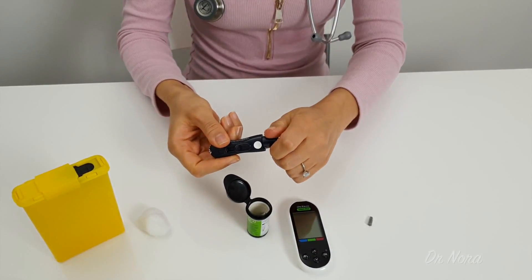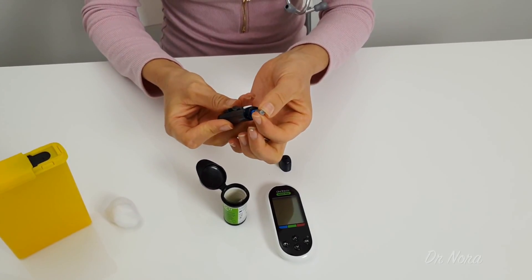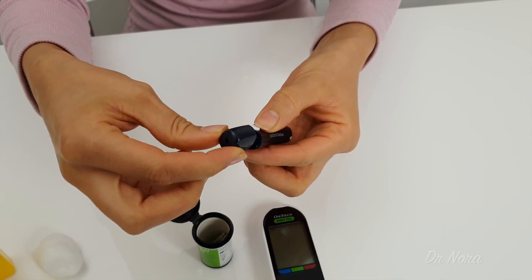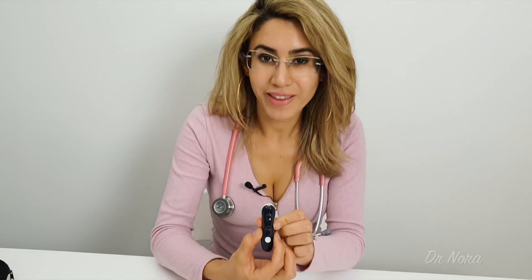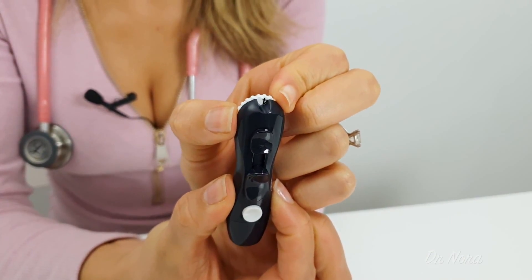The second way is to use the lancet device. You do this by loading the lancet device with your needle like so, putting the cap back on, and loading the needle. The great thing about using the lancet device is that you are able to adjust the depth of the puncture site into your skin, from one millimetre up to five millimetres. A lot of my patients prefer to use the needle directly onto their skin as it saves them time from reloading their lancet device. However, using the lancet device does give you that added benefit of controlling the depth of the needle.